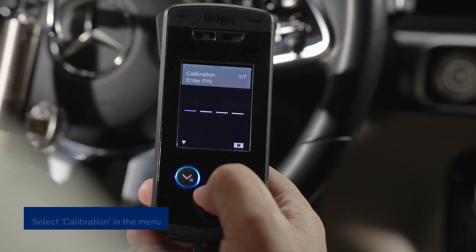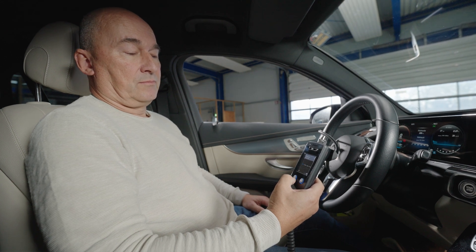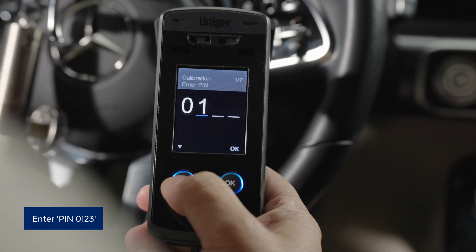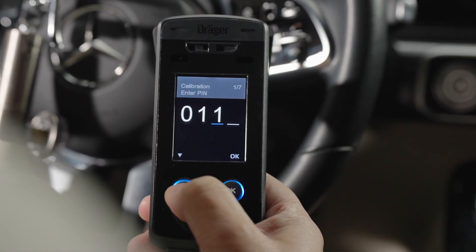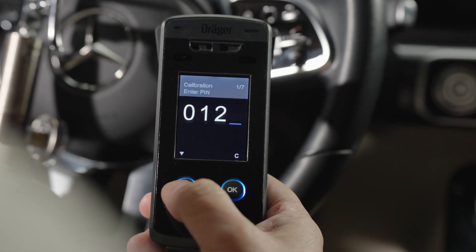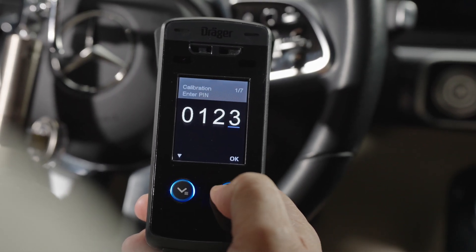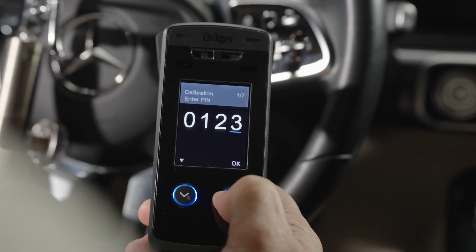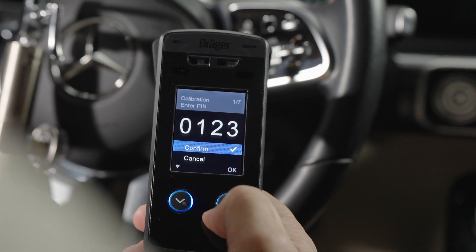Your personal PIN is included with the calibration kit. In this example, we'll use the PIN 0123. To enter the digits, press the left button to scroll through the digits, and confirm each one by pressing the right button once. When all four digits have been entered, press the right button again to confirm the complete PIN. If you make a mistake, you can cancel the entry at this point.